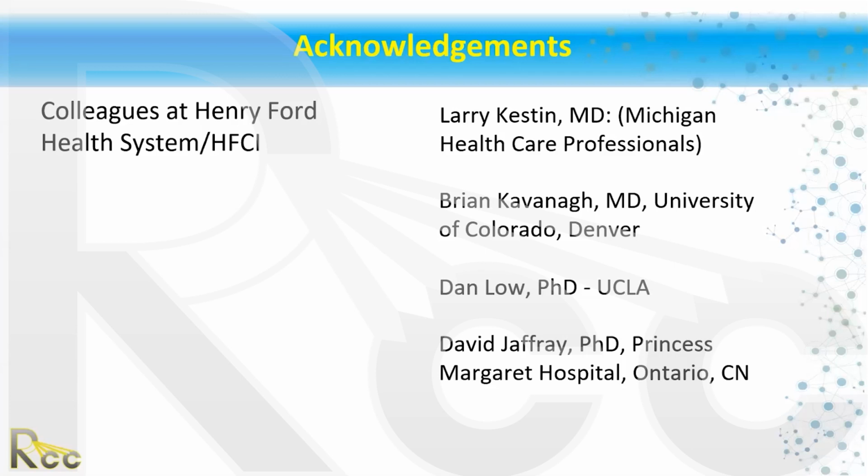Yeah. So, look, you're seeing these newer technologies now, like the Elekta machines, but also the Varian Ethos machine, where you can start doing daily adaptive. So it's a similar concept. You're able to image and treat within a reduced time frame. The one I'm familiar with is Ethos, where you don't even need a simulation. You can pull in, let's say, a diagnostic scan or something from another time point that the patient had previously.